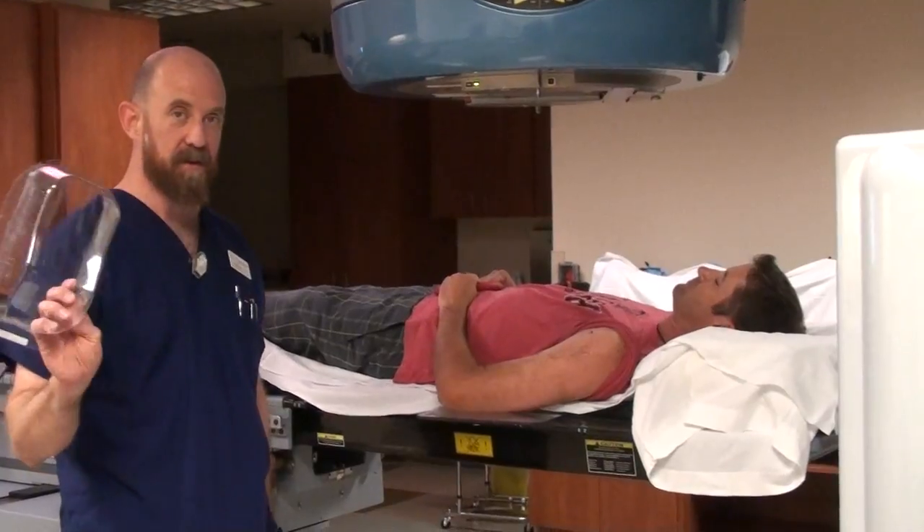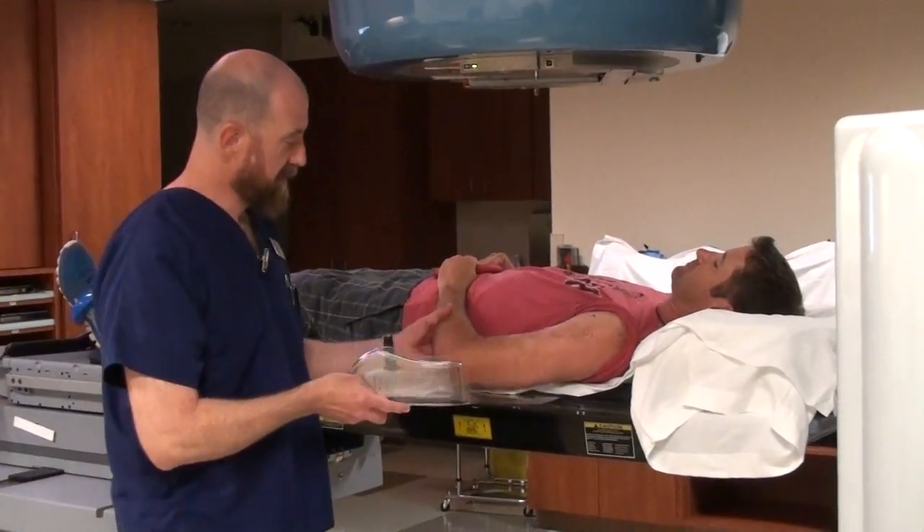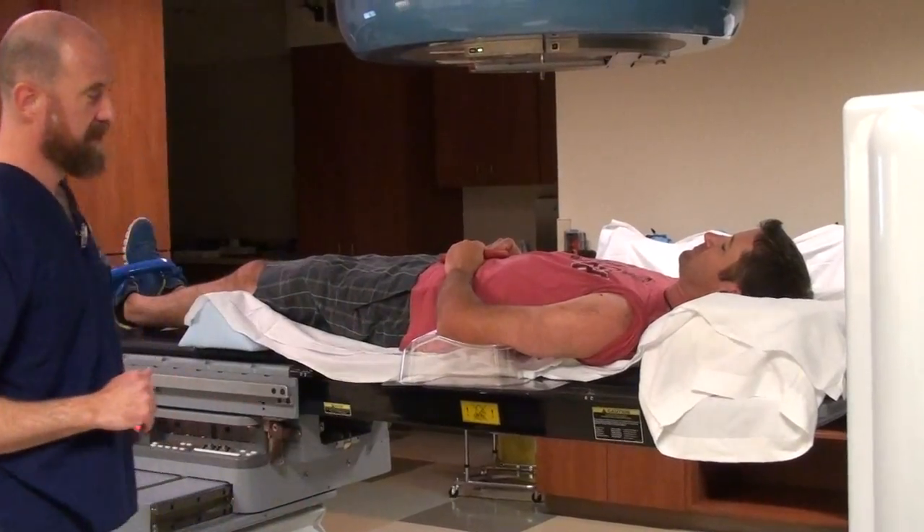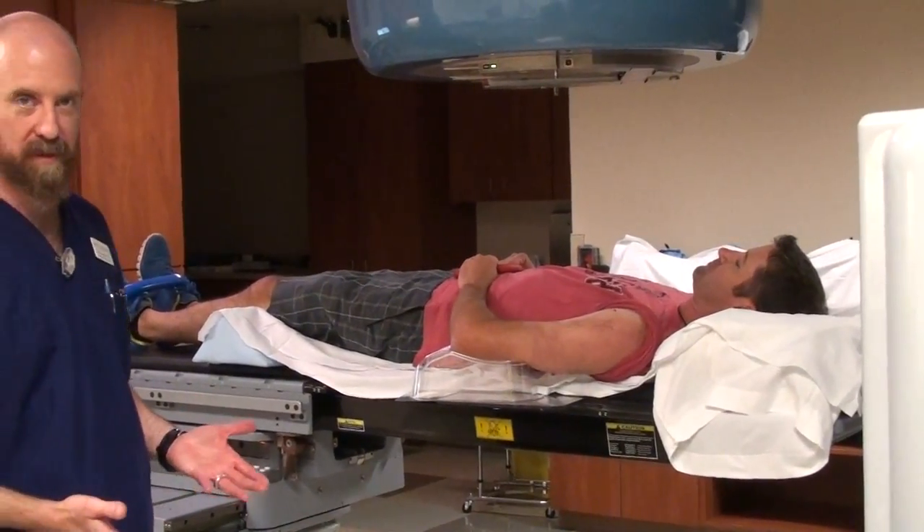For simplicity's sake, you can use a headrest. In this particular patient's case, an F headrest works nicely — it puts the humerus exactly where you want it to be.